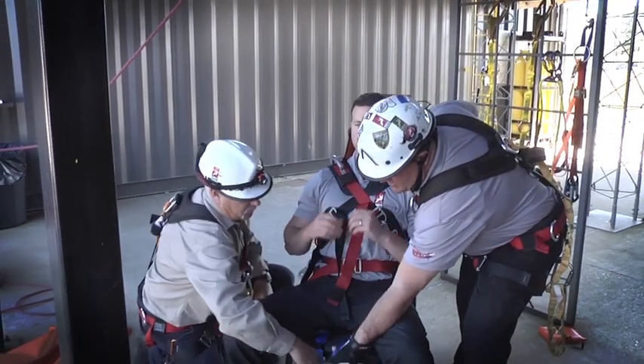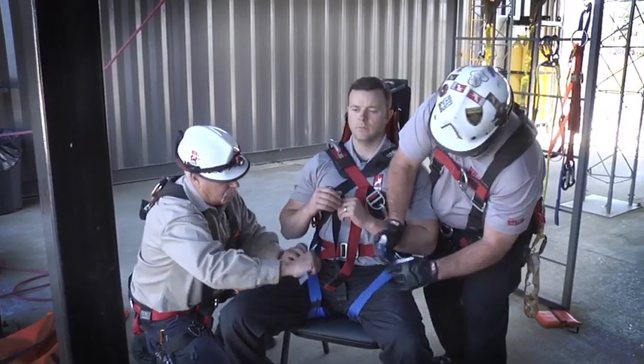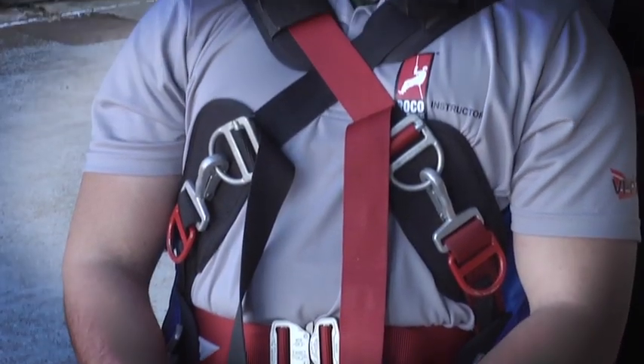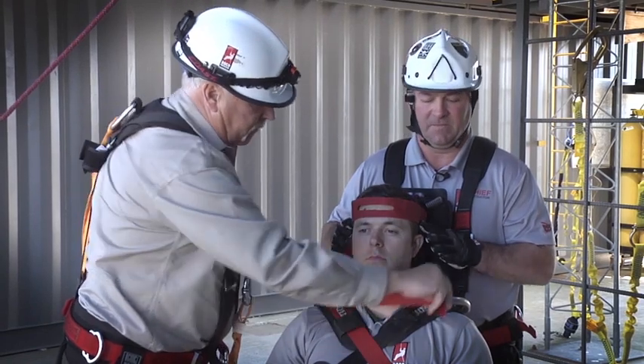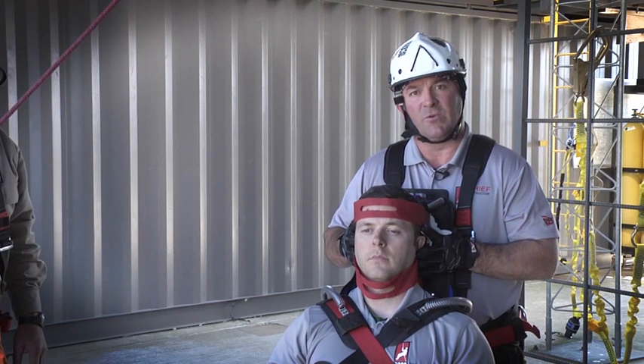Next we have the leg straps. Blue strap up here — pull it tight. Once we have the leg strap secure, we want to finish up here at the head and apply the head straps. When your partner's holding C-spine, come over the top with the head strap. Finish at the bottom with the bottom strap going across the C-collar. That's the proper application for the SpecPak.